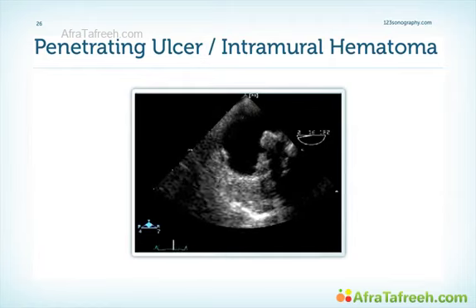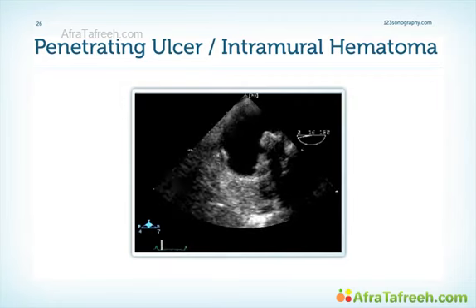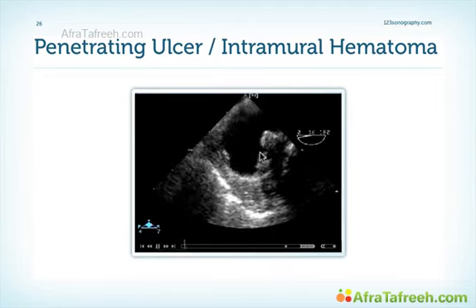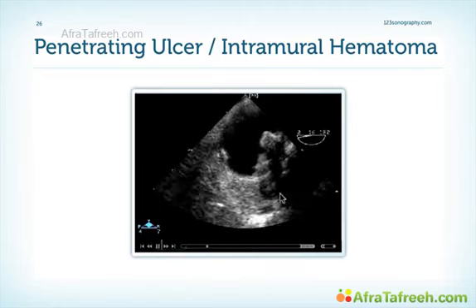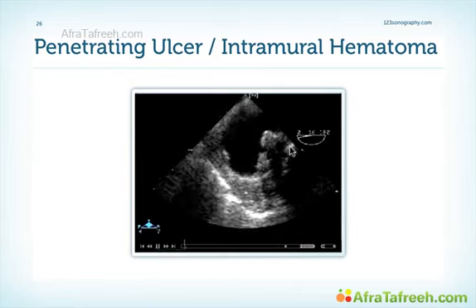But transesophageal echocardiography also offers us to look at aortic syndromes. Here's a very large plaque which is ulcerated, where we also have intramural hematoma. This certainly needs some form of treatment.